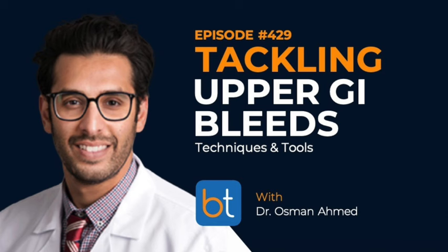For me, the closer you can get to an active bleed, that typically leans me towards using microcoils through a microcatheter. But if, as we talked about earlier, we are not doing selective embolization for active bleeding, then a lot of other embolics potentially may come into play. Again, if we're referring to a left gastric, for example, then you can feel comfortable doing maybe even a gel foam embolization of that vessel.